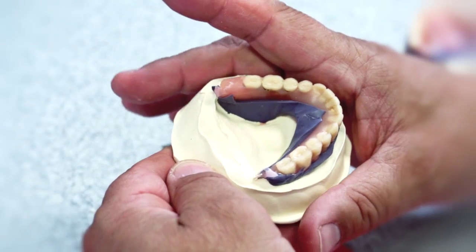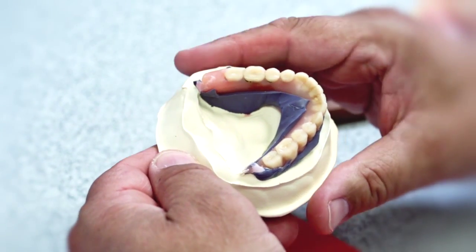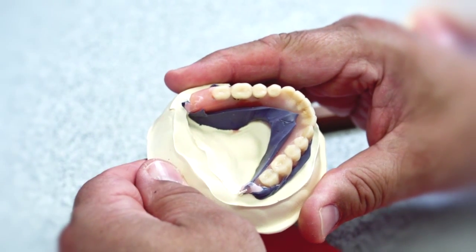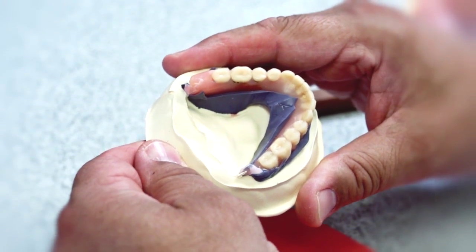Not a lot of stone. It's not a cow pie. We're not going to spend hours on the model trimmer, although with the Renfert model trimmer and the diamond disc, it trims these models very easily, and it's very quiet.